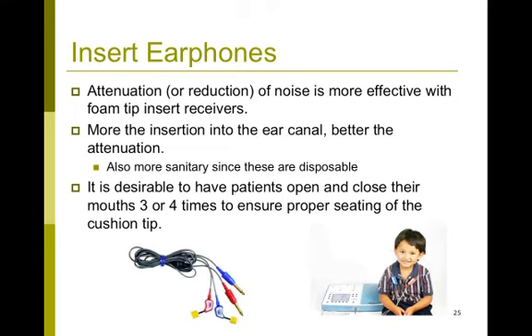Insert earphones are a preferred mode of testing for air conduction because they're comfortable. They also give us an advantage in getting better ear-specific results. And they are more sanitary because you're using disposable ear tips that are custom fit for the patient. And here's an illustration of a tip fit on an insert earphone and a patient wearing those insert earphones.